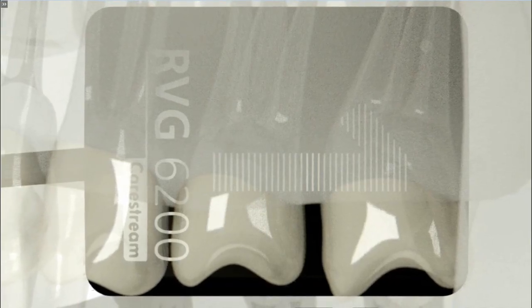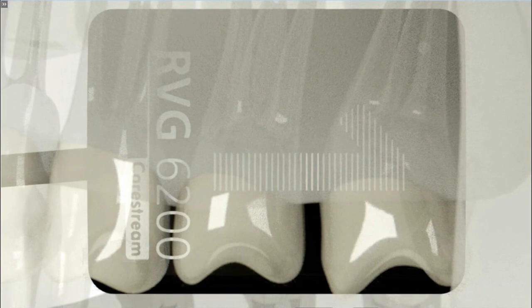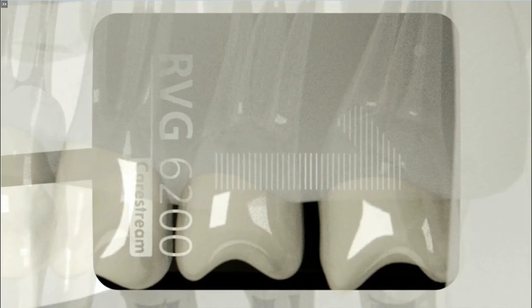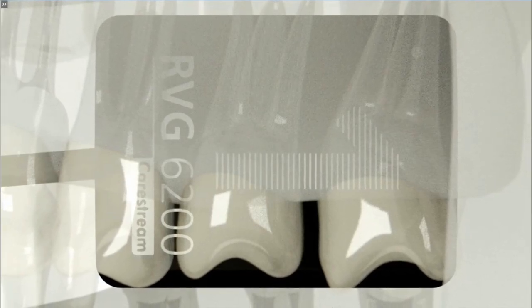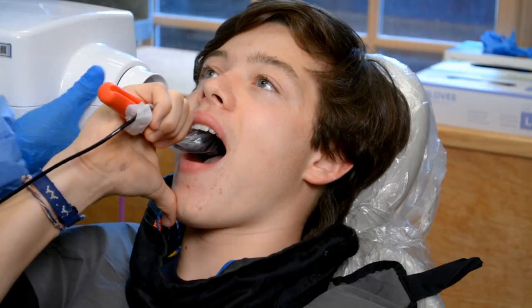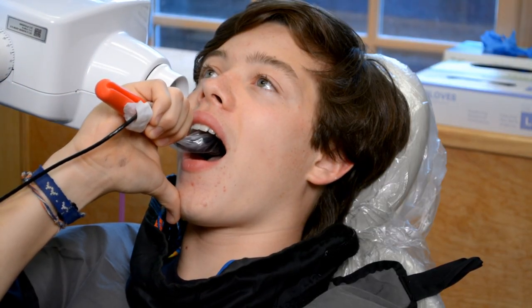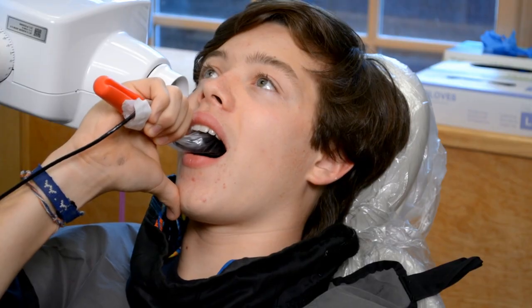if the patient still has third molars. Position the anterior edge of the sensor at the distal aspect of the second premolar, which will enable you to capture the first, second, and third molars, along with some tuberosity. Ask the patient to close their mouth, gently align the generator tube with the positioning device, and move into position to acquire the image.